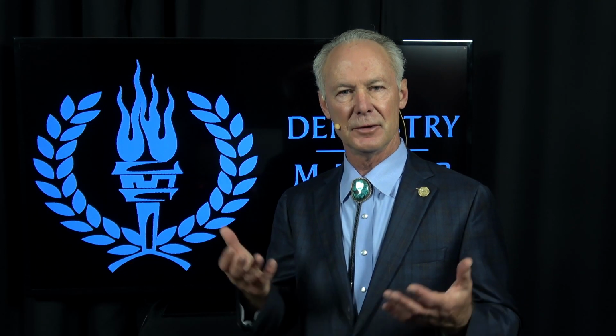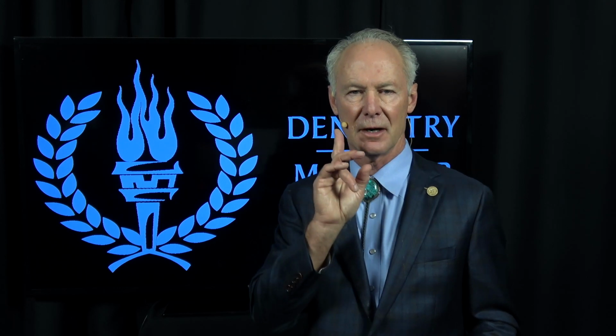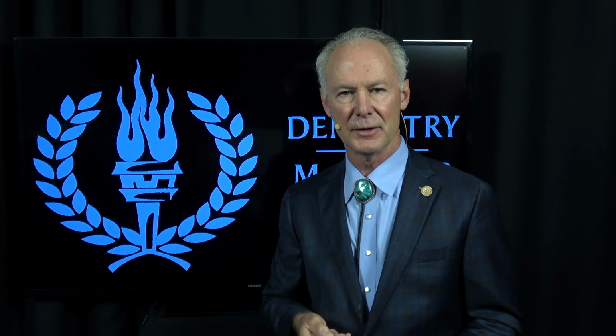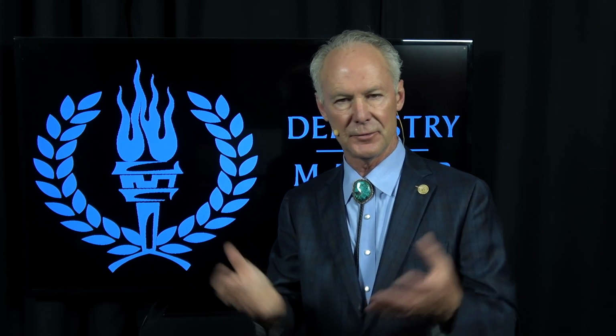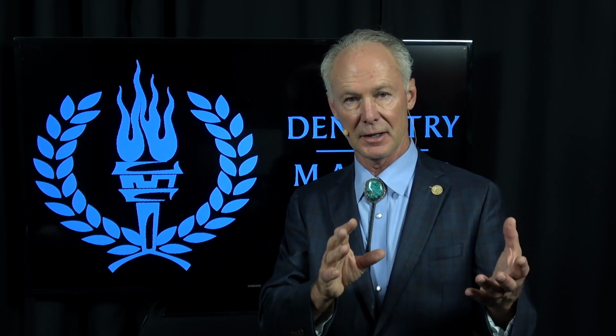Most people would prefer a fixed restoration like an implant or a fixed bridge to a removable restoration, just because with a removable restoration it fits across the top of your mouth or behind your lower teeth, and food can collect underneath it, just for a lot of reasons. Most people would rather have something that does not come in and out.